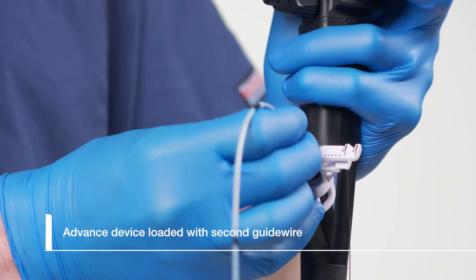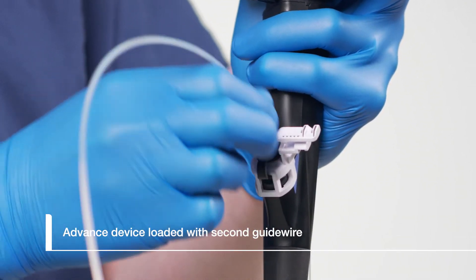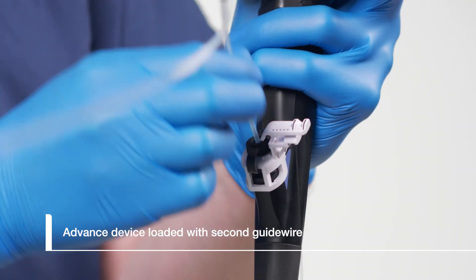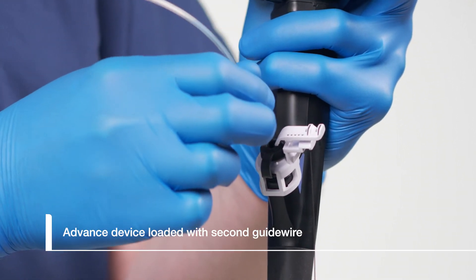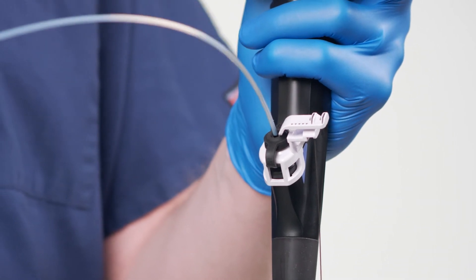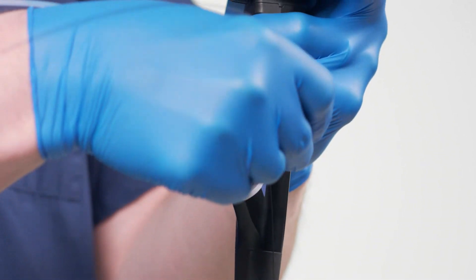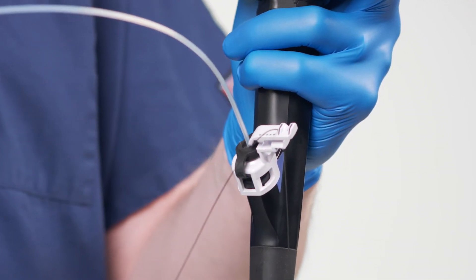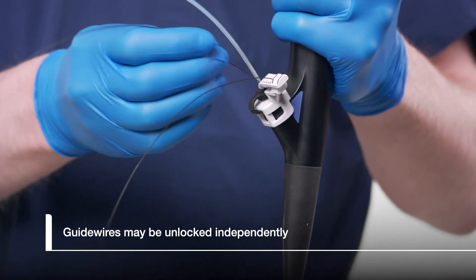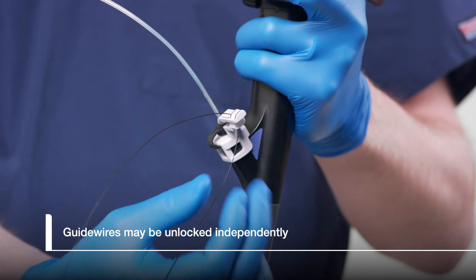Advance the sphincteratome loaded with a second guide wire into the biopsy cap alongside the first guide wire. Keep advancing the sphincteratome until it appears on the endoscopic view. When the physician is ready, strip the second guide wire down to the biopsy cap and lock it into one of the free CleverLock slots. CleverLock enables the physician to control each guide wire independently. The physician may unlock the first guide wire and adjust it without needing to unlock the second guide wire.